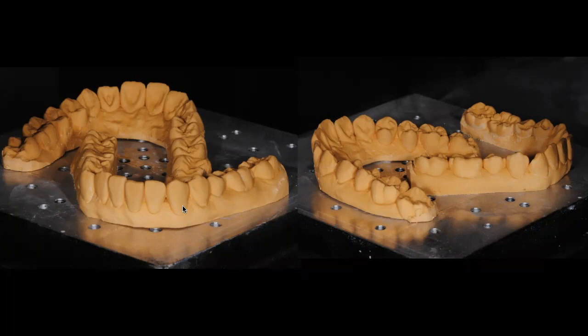There are a couple of choices out there in the market that you can use as soft trays. The one that I like and always use, and I don't use any other, is a 0.9 millimeter one, which is a very thin tray. You want these trays to interfere the least possible with the occlusion, so I don't like using thicker trays. This is the thinner one. The thinnest tray that you can find in the market is less than 1 millimeter thick, and that's the one you're going to see here.